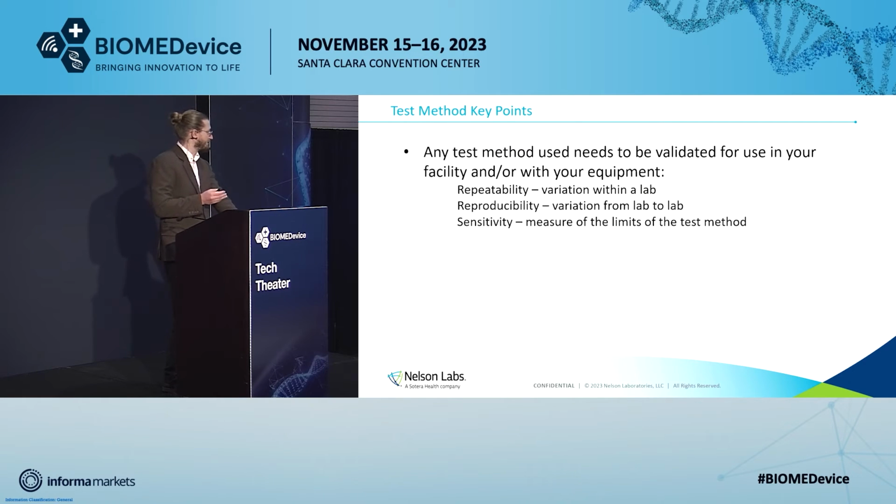So this is key. Any test method that you choose, say you're doing this in-house, right? It needs to be validated. You can't just read the standard, follow it, and say, ta-da, we met the standard requirement. You need to show that it's validated with these 3 pieces, right? So it's repeatable. If multiple personnel within your lab are performing this test, you can show that despite other people performing the test, you can still get the outcome that's expected.